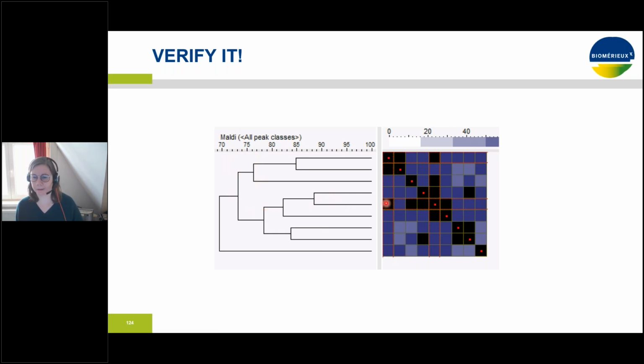Also, if you look at the similarity matrix, you actually have a few points where you can see that. So this color is a similarity. Black means it's highly similar. So this one here is actually also highly similar to this first one, as well as this one to this third one. So you can see that the separation is not that great.